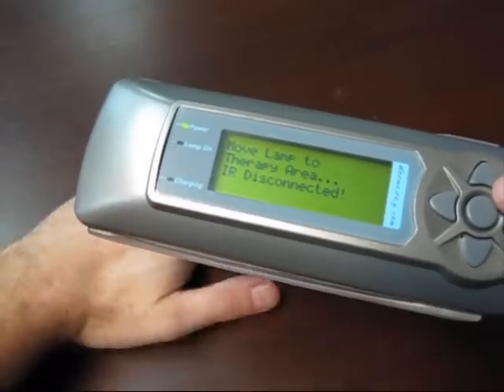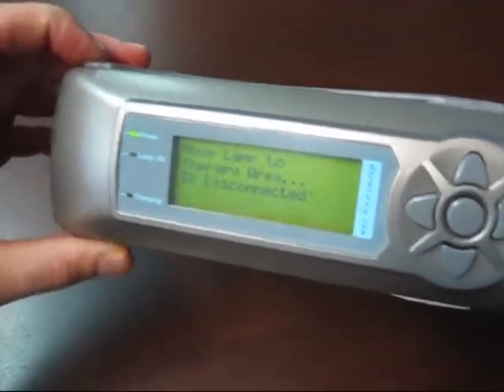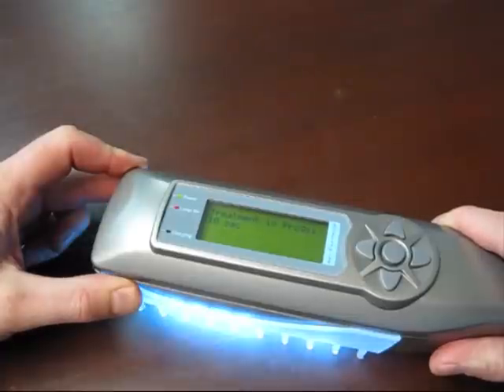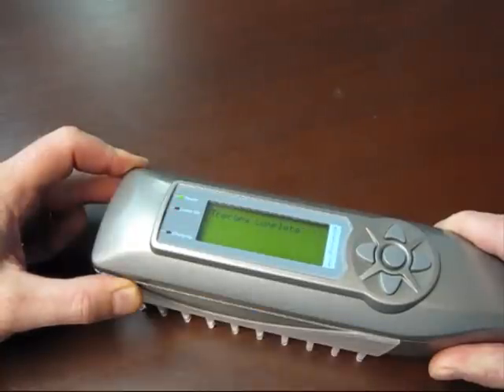Again, it won't start. There's no ultraviolet light being exposed until it detects a treatment area. So if we simulate that by putting it on the bench, it'll switch on for 10 seconds. You can see the timer. Three, two, and one, and it'll turn off.